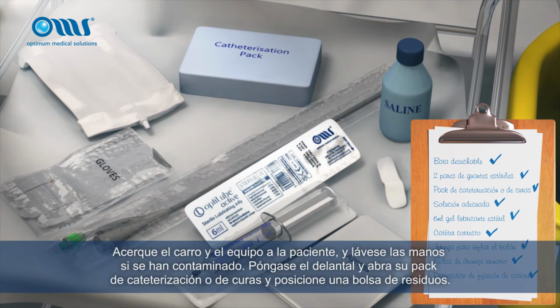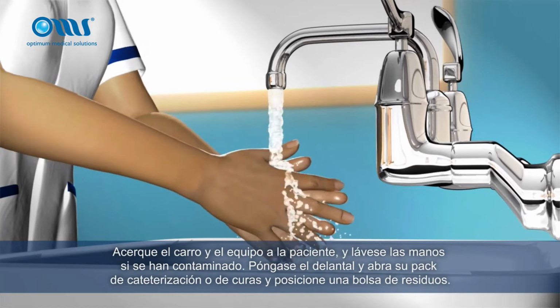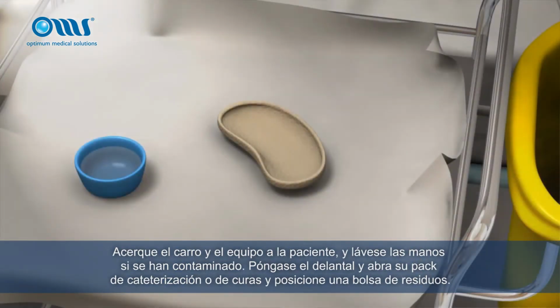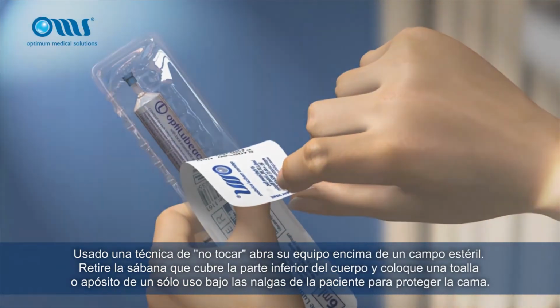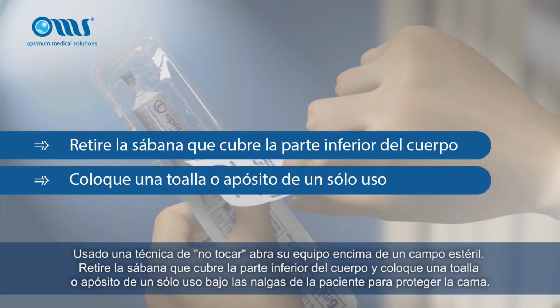Take the trolley and equipment to the patient and wash your hands if they have been contaminated. Put on the apron and open your catheter or dressing pack and position a waste bag. Using a non-touch technique, open your equipment onto the sterile field. Remove the sheet covering the lower half of the body and position a towel or disposable pad under the patient's bottom to protect the bed.